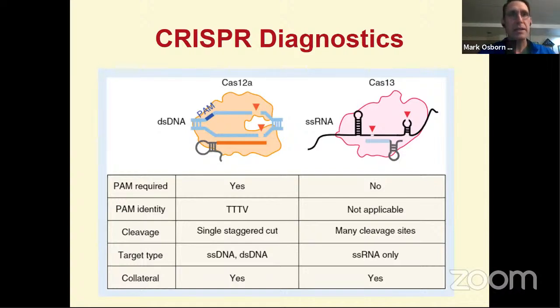And in the case of Cas12, the overall architecture is such that the enzyme is guided to, in this case, a double-stranded DNA target by a CRISPR RNA that conjugates with the Cas12 enzyme. That then interrogates the nucleic acid sequence, and base pairing occurs by Watson-Crick base pairing. And there is a requirement for a PAM, or protospacer adjacent motif, that essentially acts as the catalytic component to trigger nuclease activity. So the Cas enzyme scans across a target, and when a PAM is encountered, the nuclease event takes place. And this confers both specificity and activity properties. There are different Cas orthologs that have different PAM identities or requirements. For Cas12, it's a polythymine region. And so that's a requirement for engaging the nuclease activity.